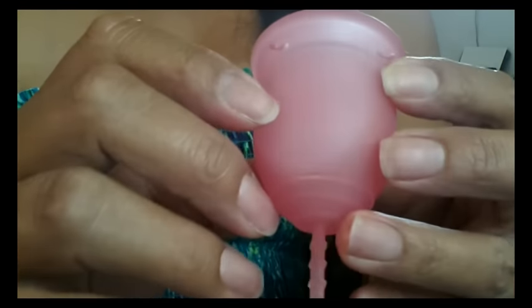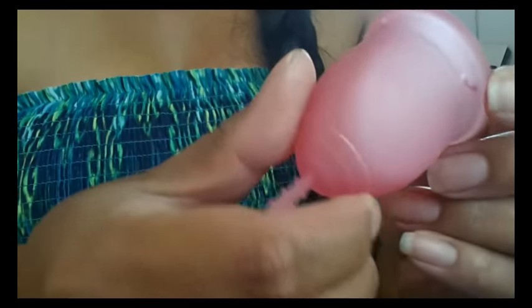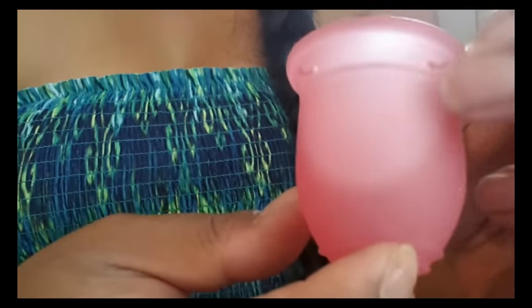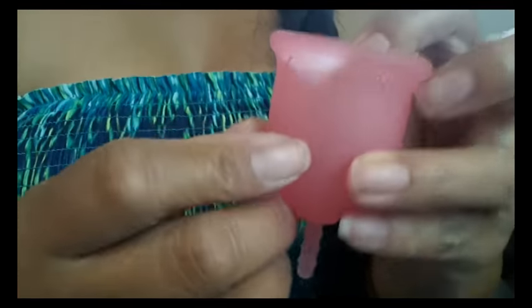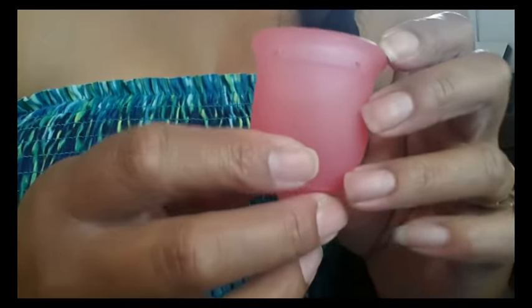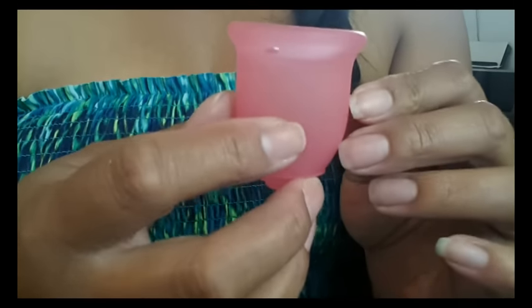They do have a seam — let me turn it here. You can barely see it but they finished it off so nicely that you can't feel it one bit on either side. I think that the newer companies are really listening to their users and reviewers to find out what little kinds of things they could change about their cup to make them more desirable.